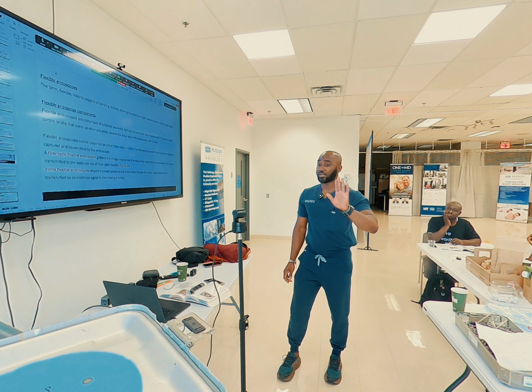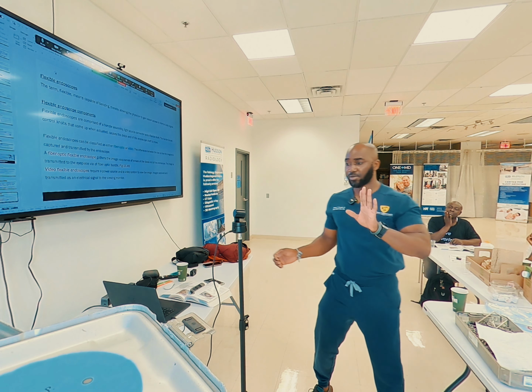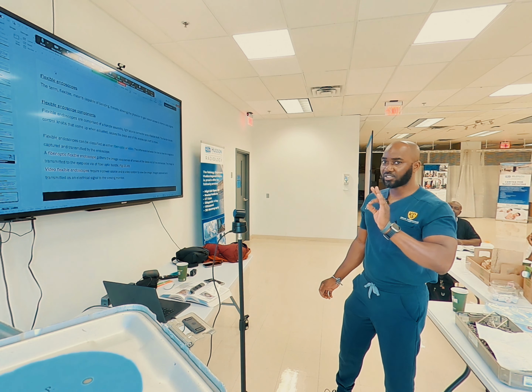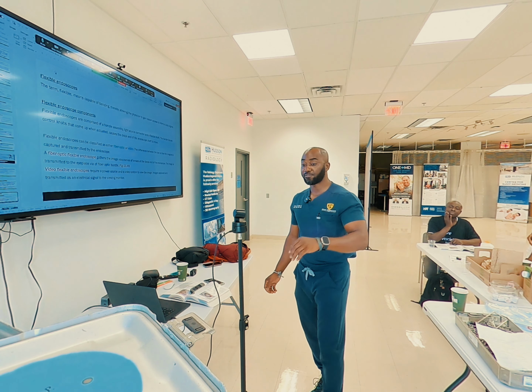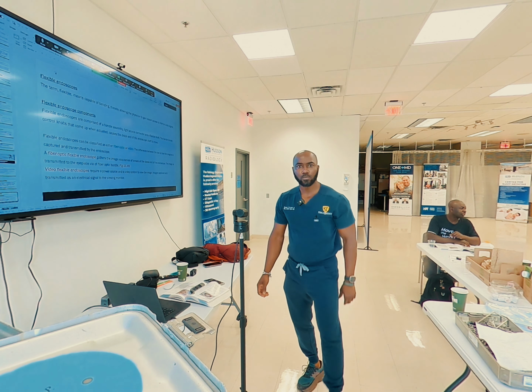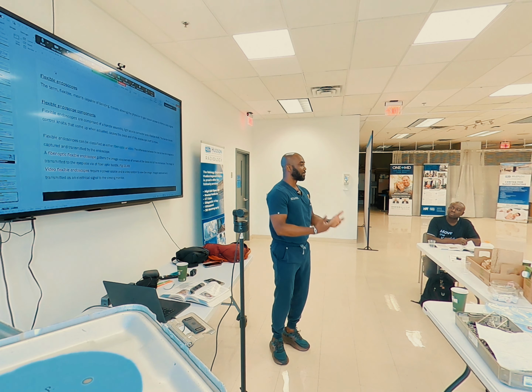No. She already did give you the class based on the Spalding classification, a semi-critical device. So that's what I wanted. So for semi-critical devices, there is a minimum requirement for sterilization or high-level disinfection. What is that minimum requirement? How do we treat them when they're decontaminated and brought to prep and pack? How do we treat semi-critical devices?